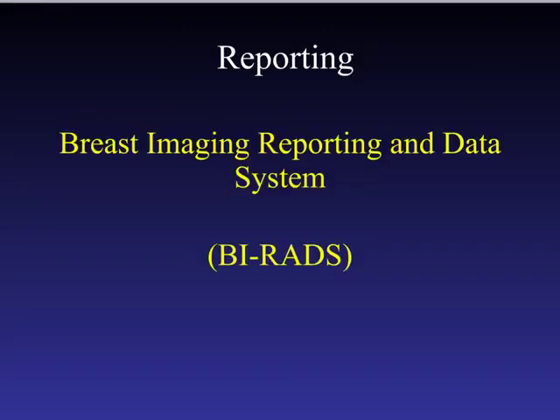Lastly, we are going to talk about how we report these imaging studies. And we use something called the Breast Imaging Reporting and Data System, otherwise known as BI-RADS, to guide how we dictate our reports and how we code each exam. The BI-RADS provides recommended words to use to describe a finding that we see on mammography, so that everybody who's reading our reports understands whether we're worried or not worried about a finding.